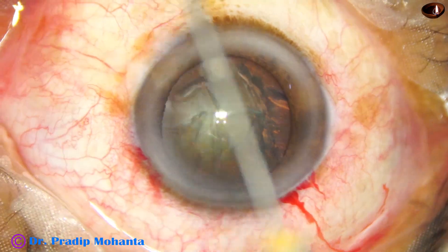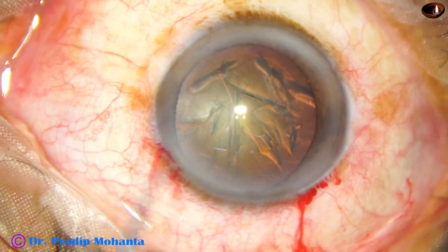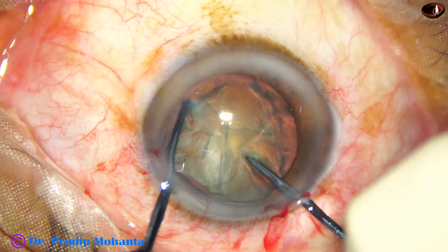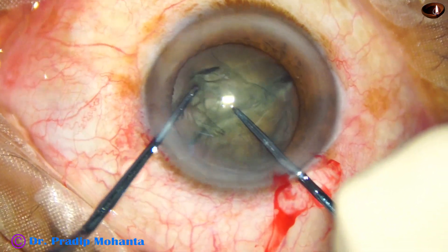Viscoelastic — 2% HPMC — is again injected and the anterior chamber is filled up. Now comes the instrument: Mohanta's prechaopper. This straight prechaopper has been designed by me. The left hand instrument is a nuclear sustainer. This is real time video.